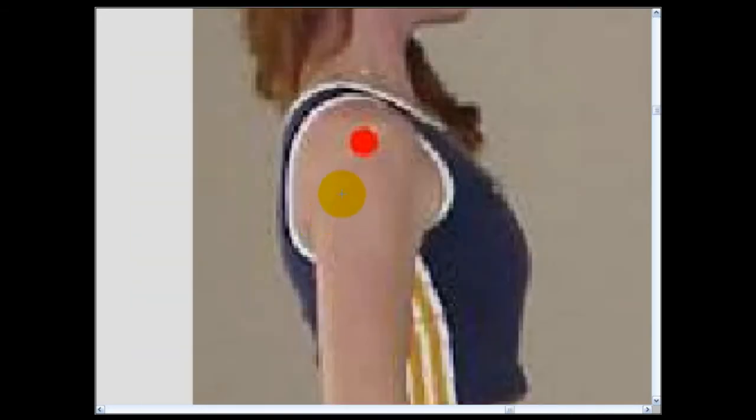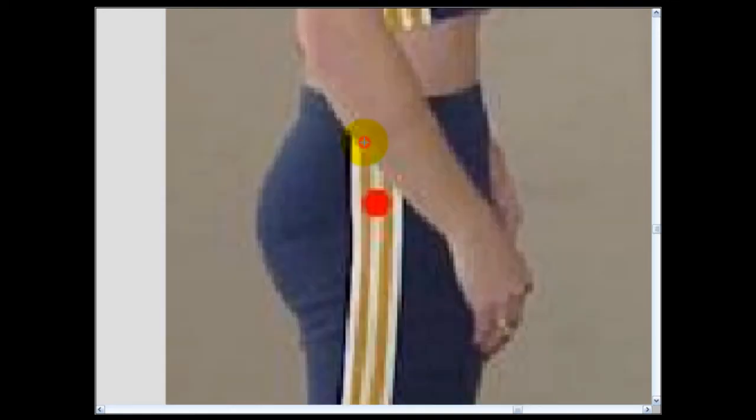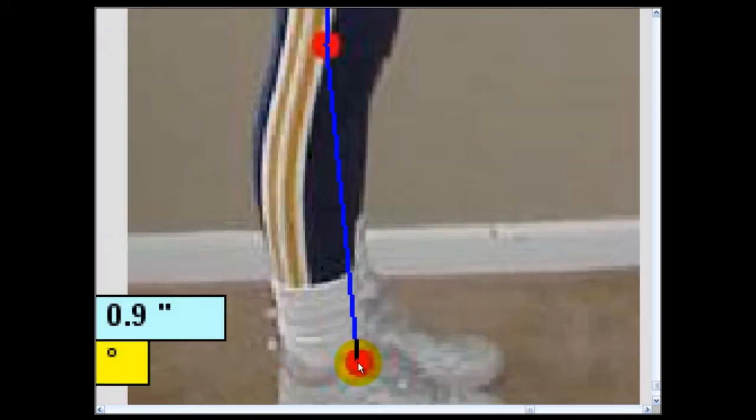We place the crosshair right in the center of the red dot and click. The software immediately jumps down to the next point, and we repeat the process — jumping to the next point, the next point, and the last point. After the last point is clicked, the image zooms back out and all the numbers are generated on the screen, creating a Posture Number of 7.